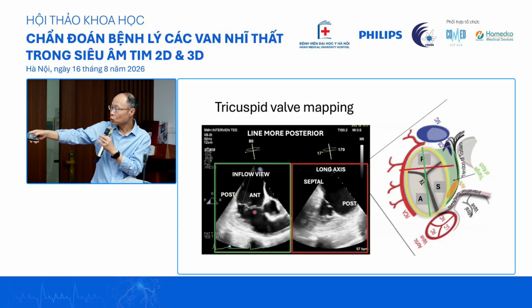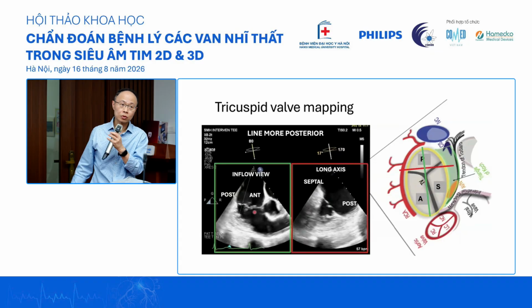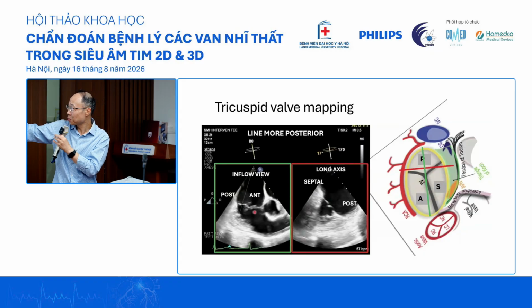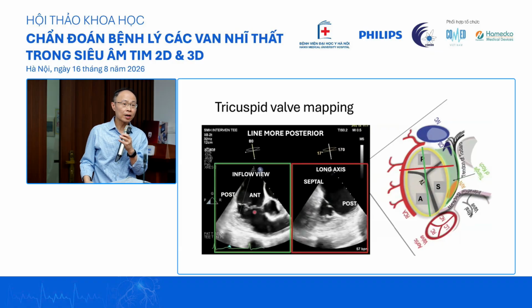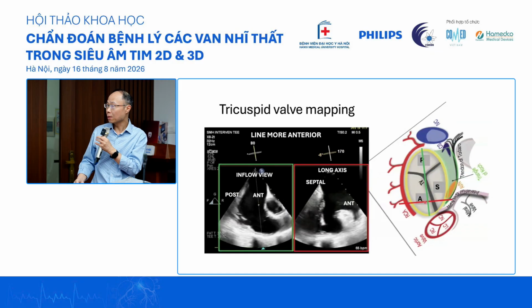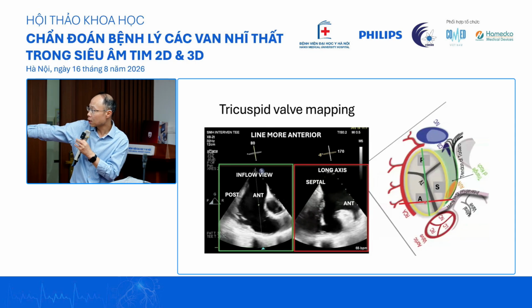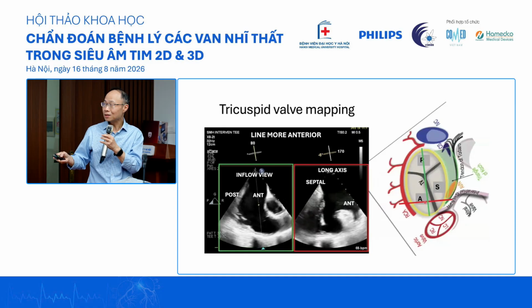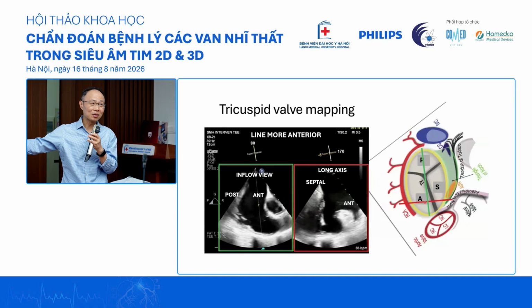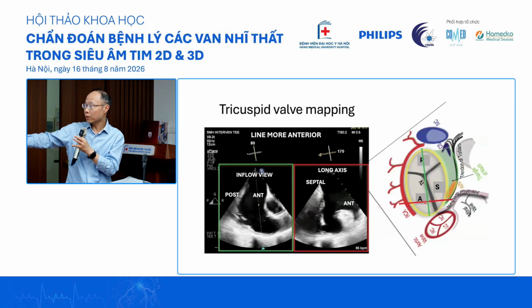And when you do that, the other X plane is going to show you right up here the septal and posterior, which also means that if you turn the other way around, you're going to get AP, but this red line here is going to be anterior and septal. So I think X plane for me is more reliable. So this is another one. You turn it around this way, going down here, you're going to get more of an anterior and septal leaflet. And this is the most important, because with respect to tricuspid clip, this is where we're going to clip.